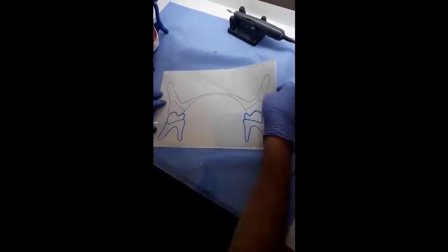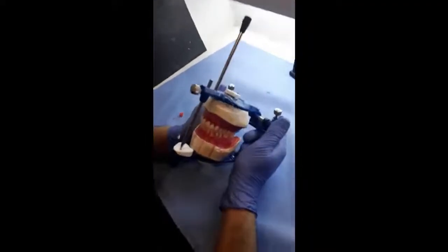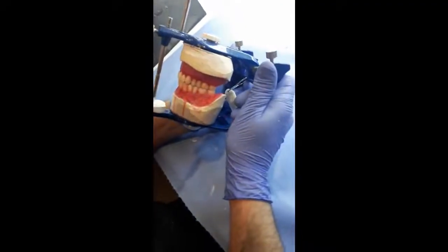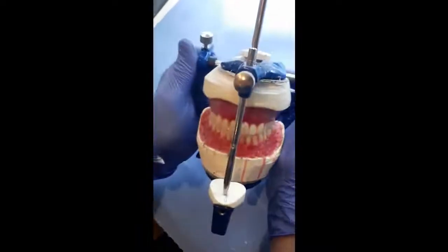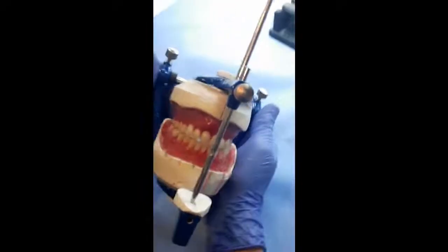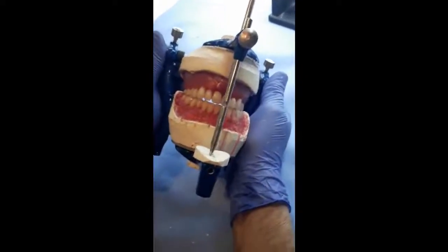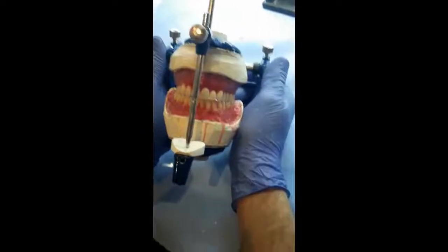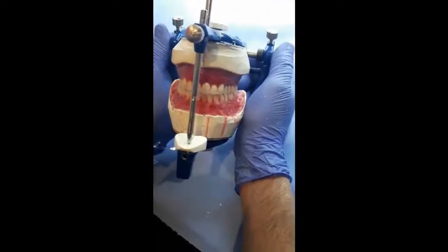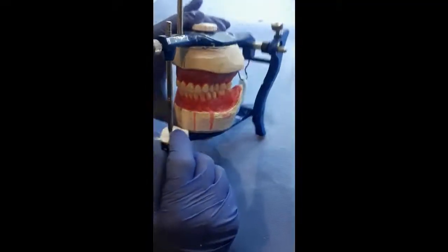Now this diagram explained the relationship you need to check on the articulator. Here we have buccal to buccal cusp, and this is called the working side, and we have here a touch between the palatal upper and buccal lower, and you can see that the pin is not separating from the incisal guidance table.